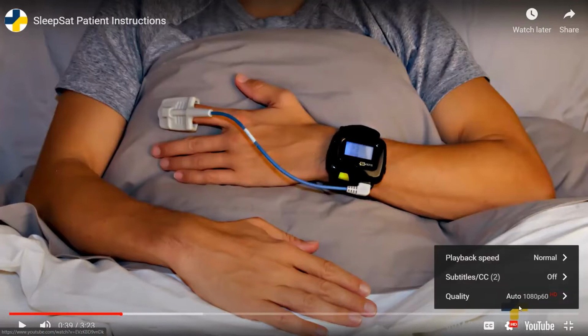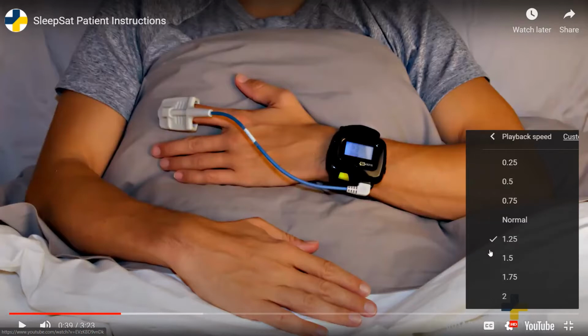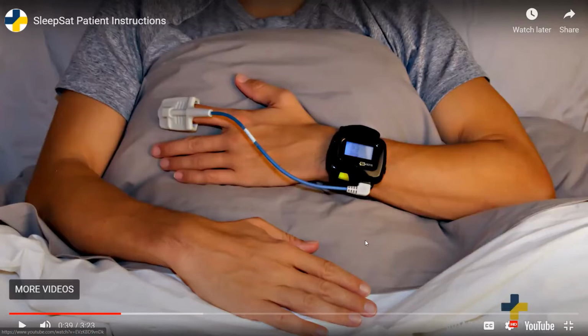I'm also going to take the time to speed up this playback speed just a little bit. I want to respect your time as best as I can. This has a bit of a soft cadence for the sake of the patient, but we do have quite a bit of content to get through today. Charge device fully between nights.